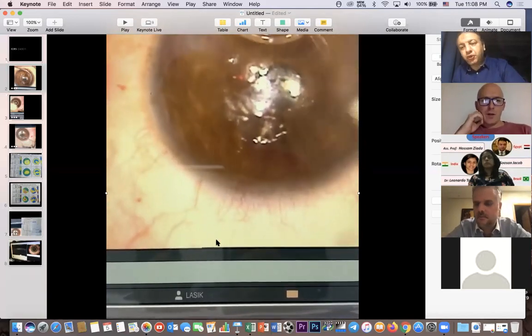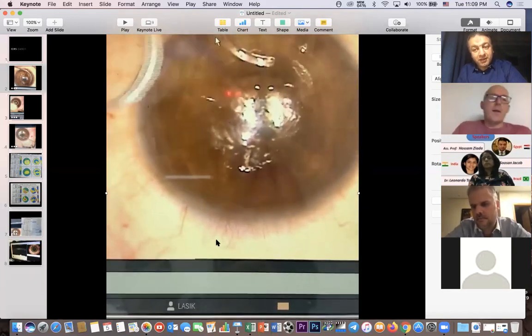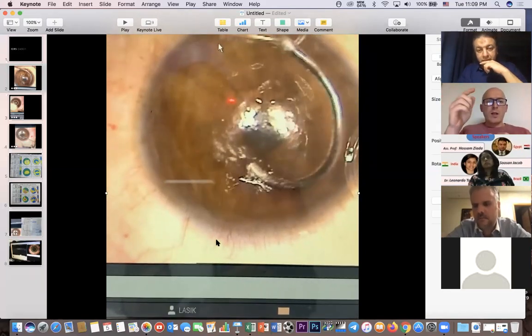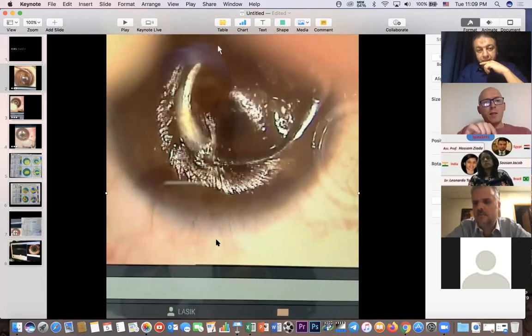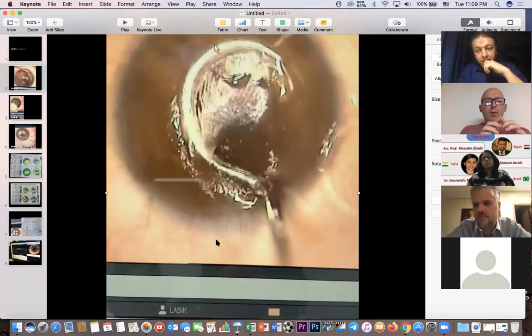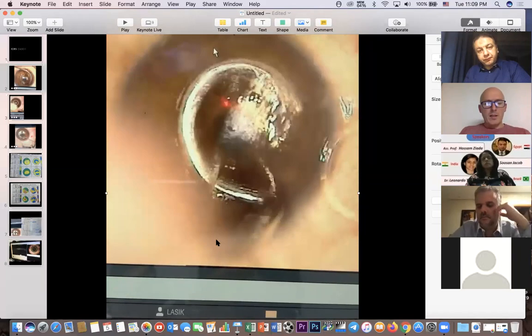I'm using the 320 arc length. Yes, there are some steps. Very careful. Usually, when you use femto, you try to make very narrow tunnels to improve the results. The only exception should be the 320, because there is a vector of force during the implantation, and if it is too narrow, it is difficult to implant it. So in this case, I try to make the tunnels a little bit larger, apart from the internal dissection and external, to not have problems implanting.